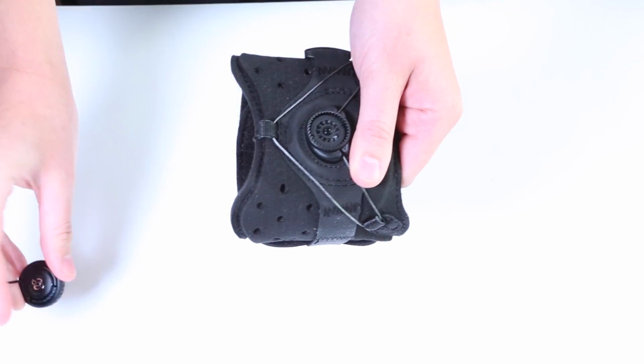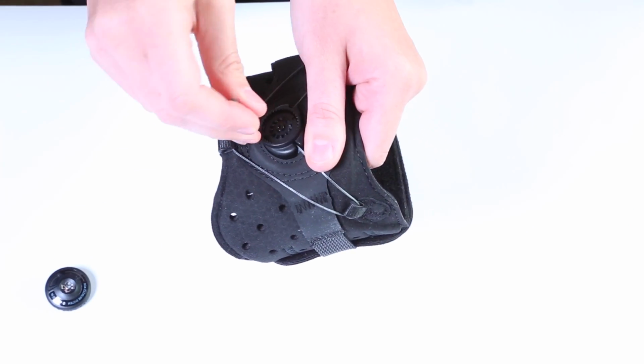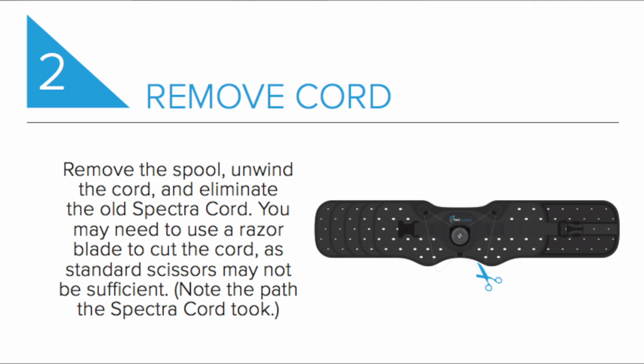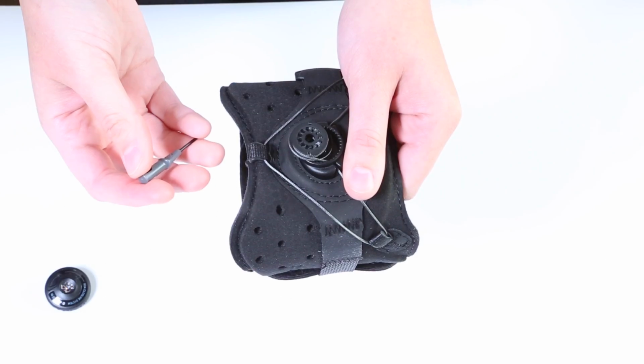So I've unscrewed the dial. Now I see my spool, I can just pop that right out. I like to use a screwdriver. Step two, we're going to remove the cord.